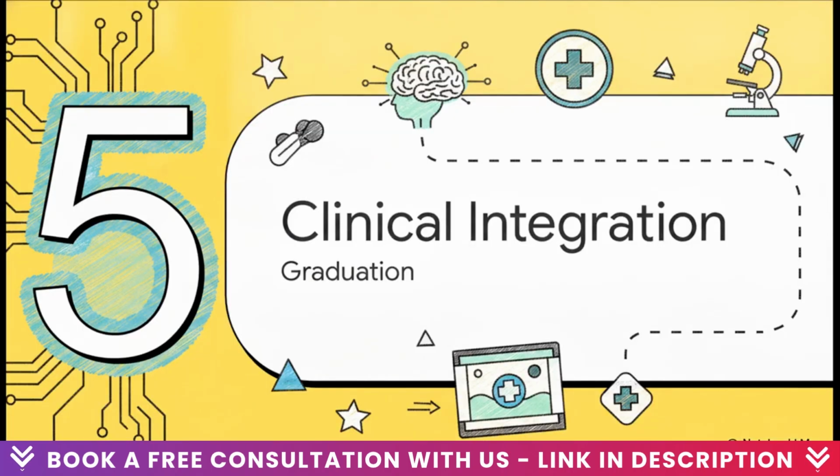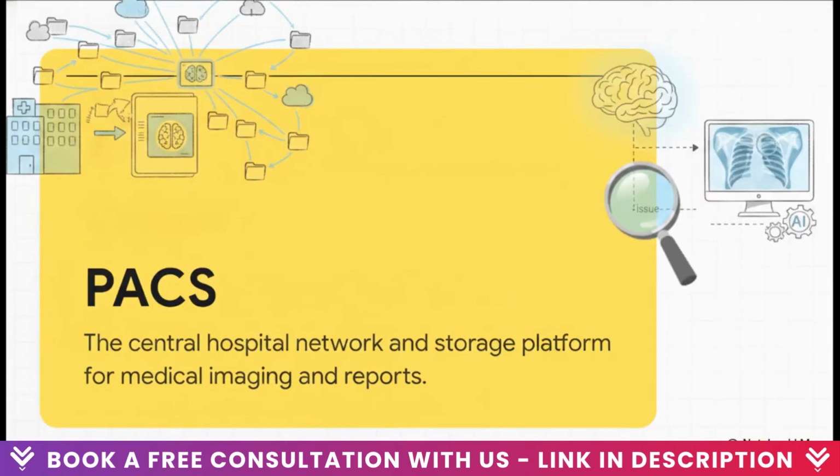And that brings us to our final stage, Step 5, clinical integration, graduation. Finally, our model passes its tests and leaves the laboratory for the real world. But listen, an AI is completely useless if doctors can't actually easily access it. So, the model is integrated directly into a hospital's PACS, the Picture Archiving and Communication System. PACS is the massive central network where all hospital imaging is stored and routed. By plugging seamlessly into this PACS architecture, the AI acts as a computer-aided diagnosis, or CAD tool. It works silently in the background, automatically flagging issues and streamlining the radiologist's daily workflow without ever requiring them to open a separate piece of software.